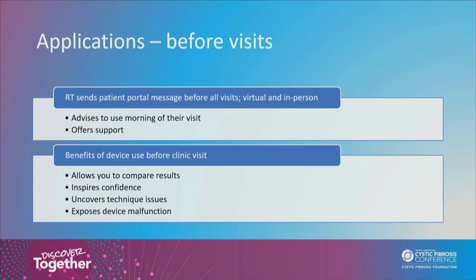It can also uncover technical or technique issues and allows us an opportunity to discuss this more in depth with the patient during that visit. Device malfunction may also be uncovered this way, and we can then assist the patient with obtaining a new device if we feel like that is the issue.